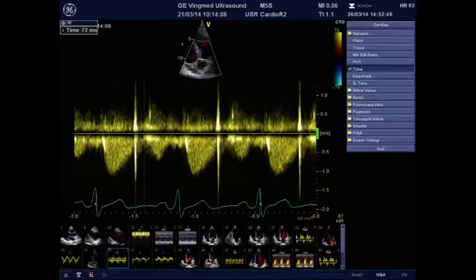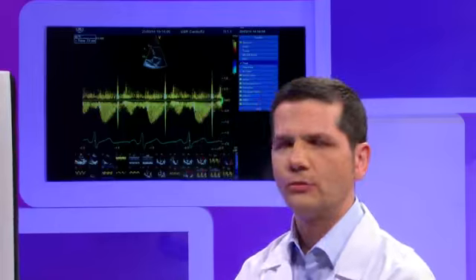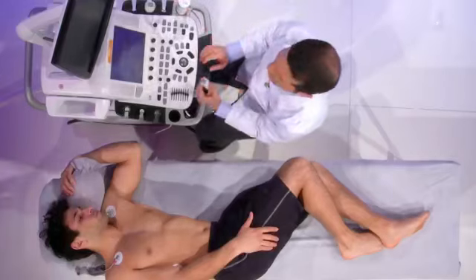However, in later stages, when left atrial pressure increases, this will lead to a pseudonormalization, shortening the isovolumic relaxation time back again. And so this is a disadvantage because, again, also here, we sometimes cannot say whether a certain measurement is normal or pseudonormal. But in concert, using it together with other parameters, as I said from the beginning, it can help us to get the conclusion.